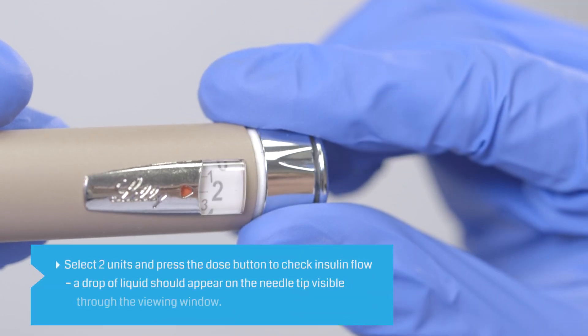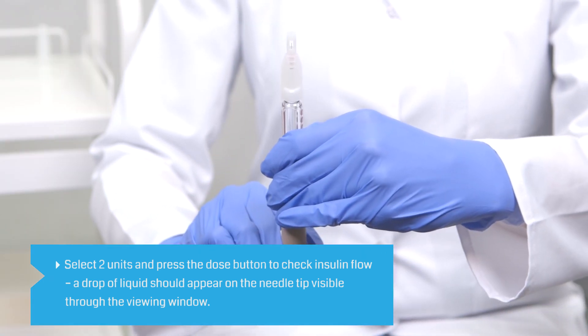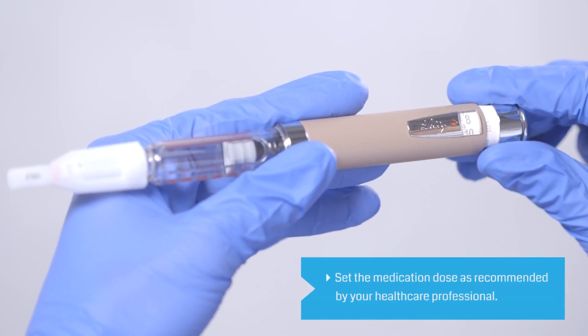To check insulin flow, select two units and press the dose button until you see a drop of liquid on the needle tip, visible through the viewing window. Use a new safety pin needle if the flow test was not successful.